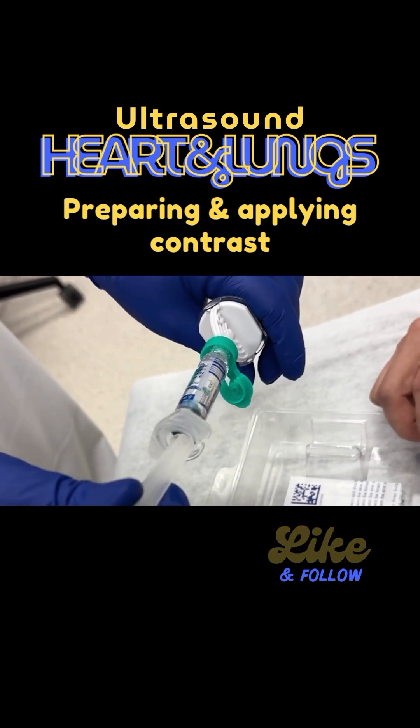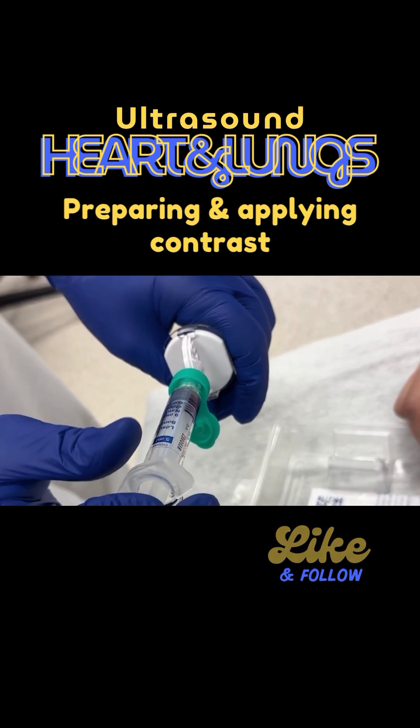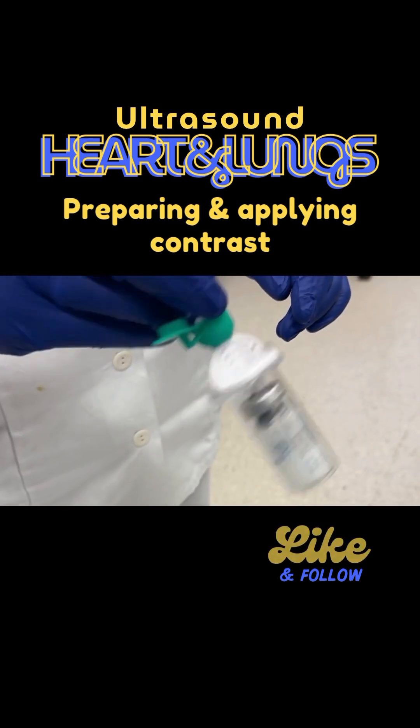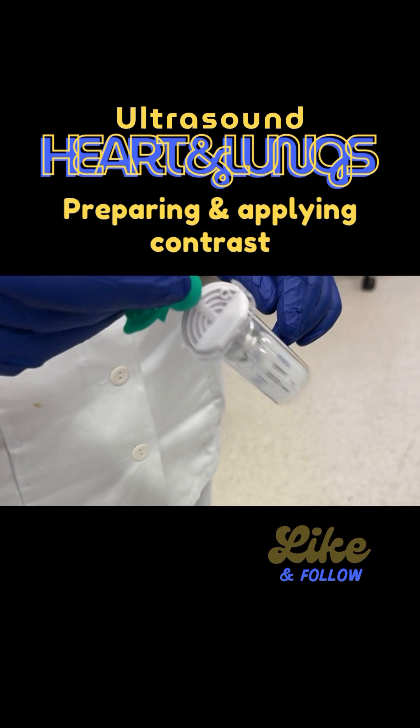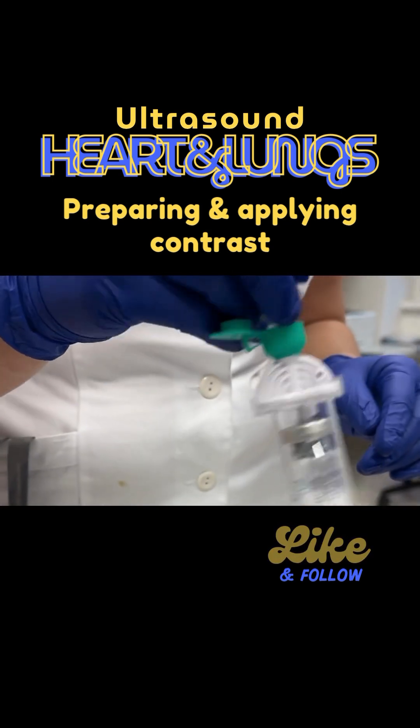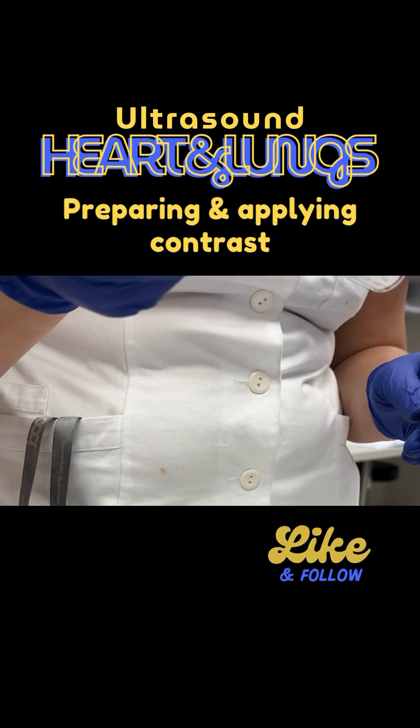Then you attach the fluid and also the syringe, apply it, and then you shake it. Don't shake it too hard as that already destroys some bubbles, but with this you can create a nice solution of Sonovue.